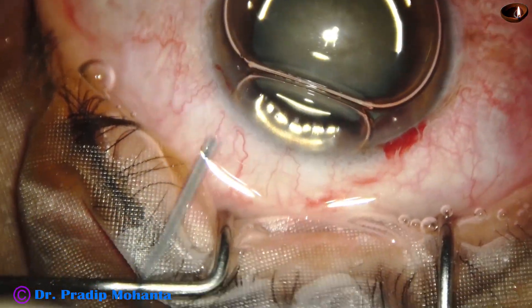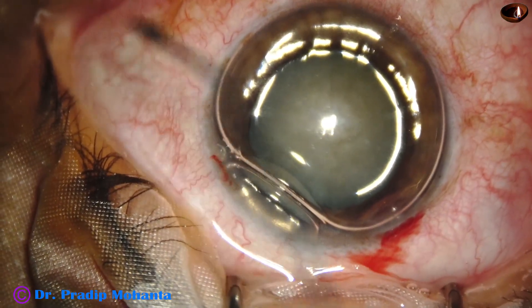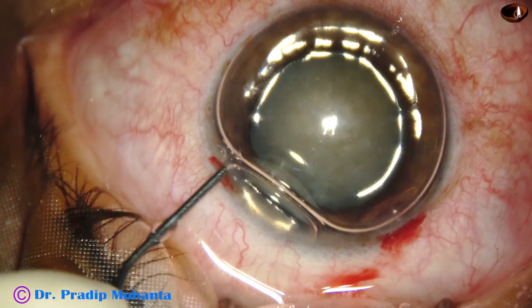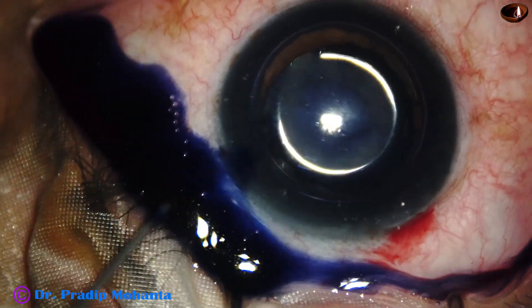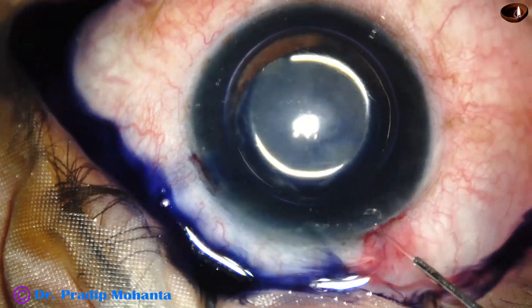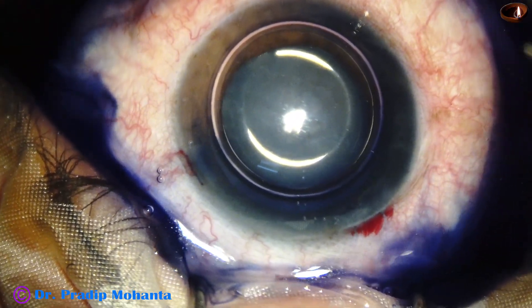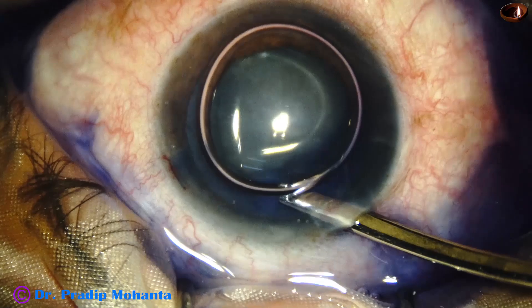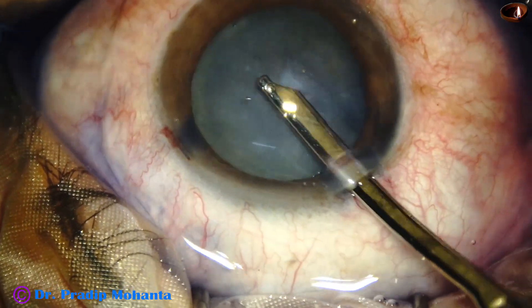You can see this is a white cataract. To get some contrast, we are going to stain the anterior capsule of the cataract with trypan blue dye. The dye should touch all parts of the anterior capsule. This is a bit of adrenalin. And now the dye is washed out with the help of this 23G Simcoe and BSS.